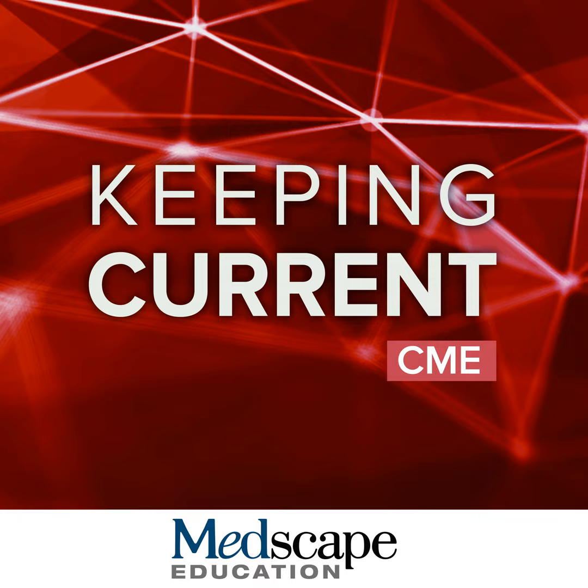I think everybody is already performing FLAIR, so that's not a big deal. The issue is that the microhemorrhages, if you don't run your sequences correctly in order to detect them, they may be hidden. And so this is where running the right protocol is really important, both for baseline and for monitoring. And this is a link on this slide that can take you to the ASNR website that can get you links to downloadable protocols, as well as more details if you want to try to build it yourself on the scanner.